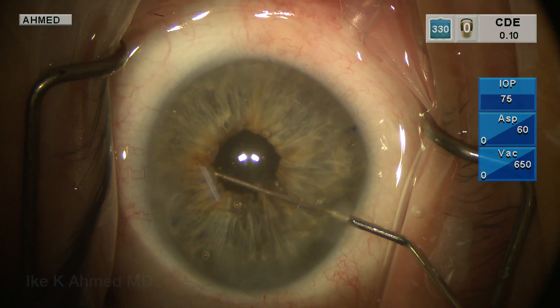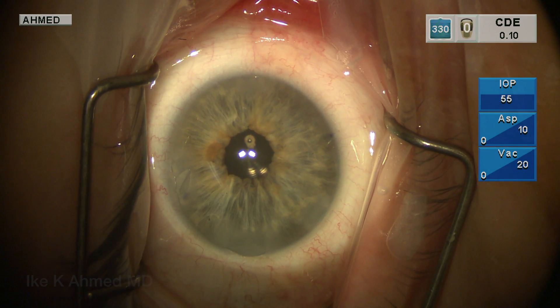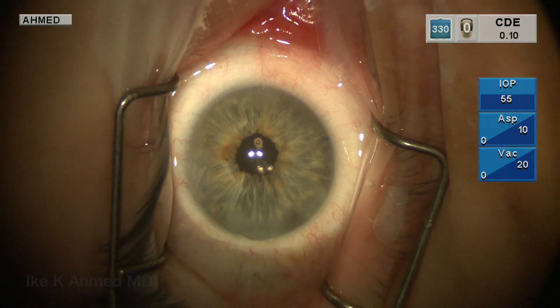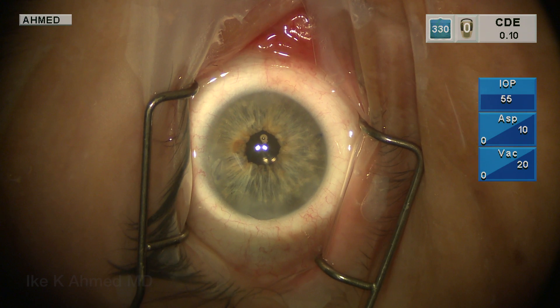We will then basically spread the iris around the pupil margin to avoid any bunching up of the iris in one particular spot. And here we see the multifocal lens well-centered with a well-centered pupillary cerclage that has closed the iris now to adequate size.